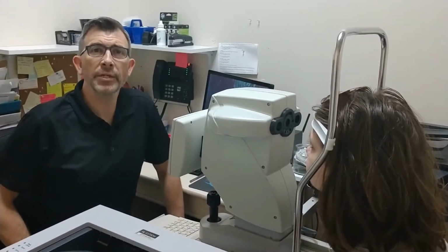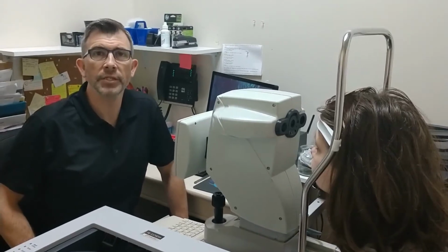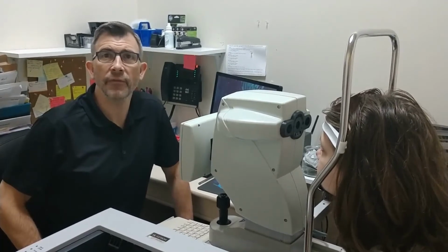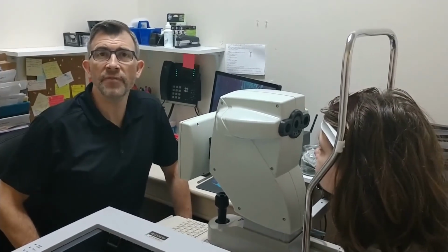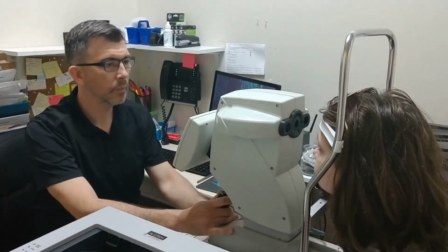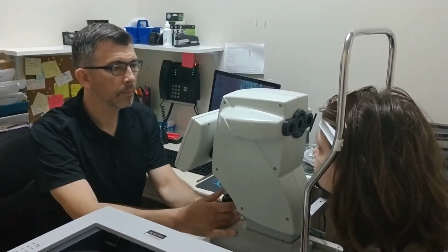The most important way we measure progression in all of our myopia control patients is by tracking the patient's axial length. The axial length is the length of the eye from front to back. We measure this using a sophisticated piece of equipment called the IOL master. The IOL master can accurately measure axial length to the 100th of a millimeter. As the child grows, the axial length increases. However, when a child is becoming more nearsighted, this increases faster than it should. Measuring axial length gives us a powerful way to track for myopia progression.